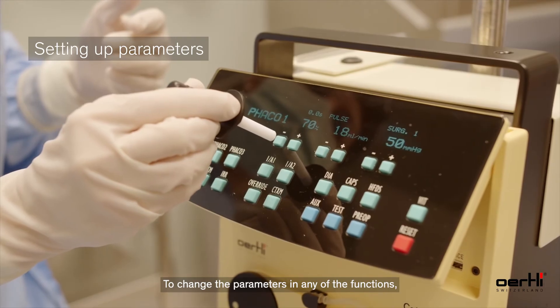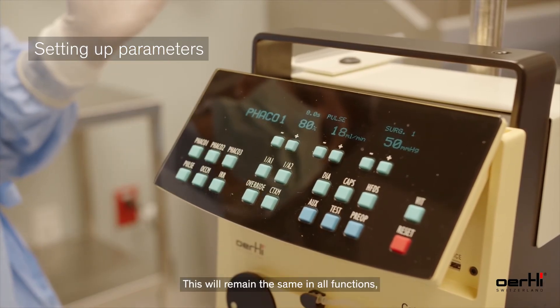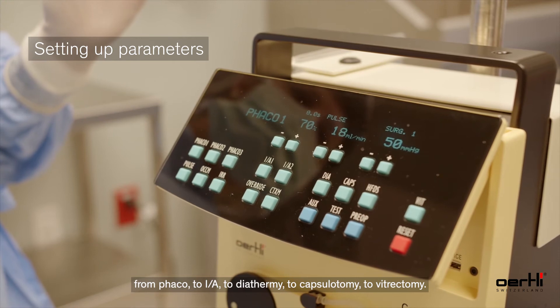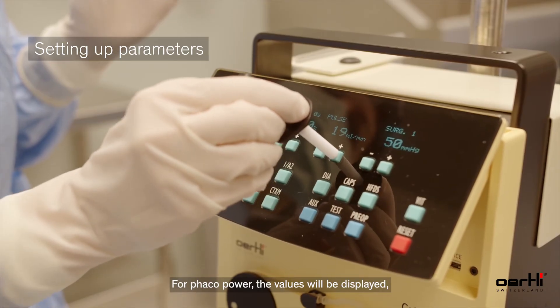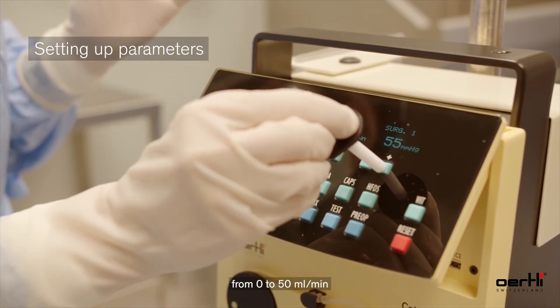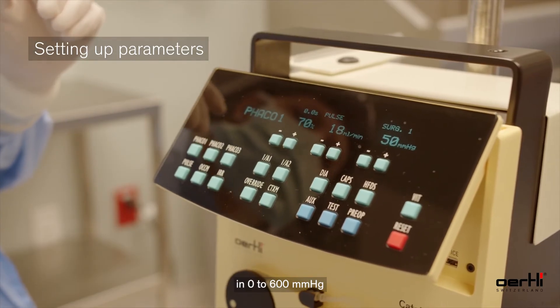To change the parameters in any of the functions, press the plus or minus keys under the indicated parameter. This remains the same across all functions — from FACO to IA to diathermy to capsulotomy to vitrectomy. For FACO power, values are displayed from 0 to 100%. For flow, values are displayed from 0 to 50 milliliters per minute. For vacuum, parameters are displayed from 0 to 600 millimeters of mercury.